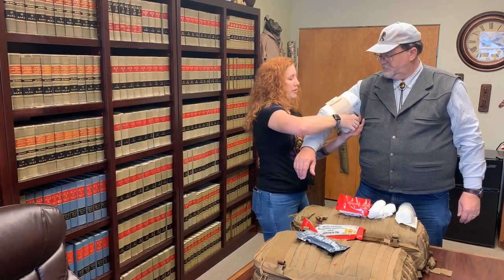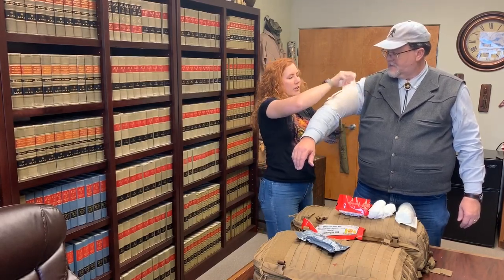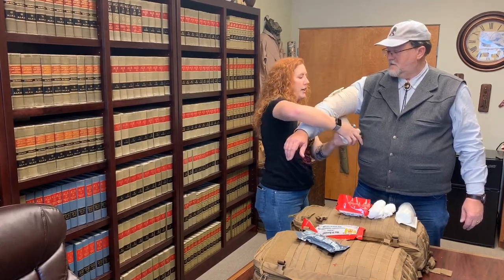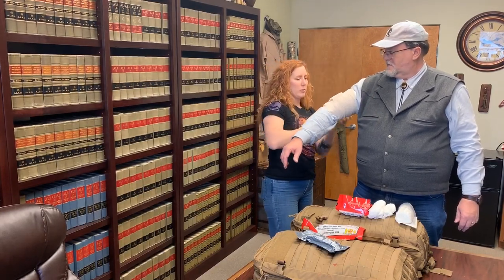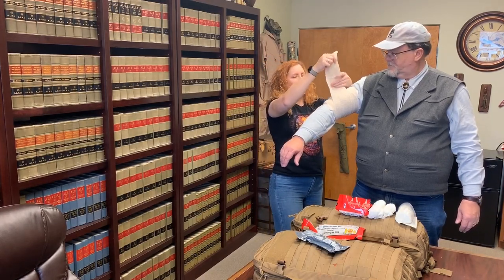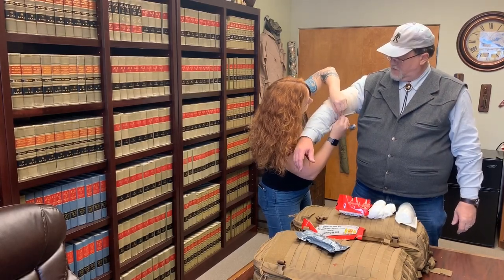It has Velcro on it for security, and you wrap it to cover that bandage on both sides, covering the under-dressing. Once you get that done, you bring it around both sides of the H-clip. If you lose your grip on it, it's still going to stay secure. It also adds direct pressure onto the point where the injury is. You wrap it across, making sure the bandage isn't sticking out anywhere. On the end it's got another piece of Velcro to secure it, and the clips hook into the sides of the last wrap.